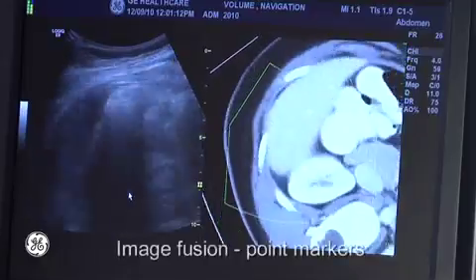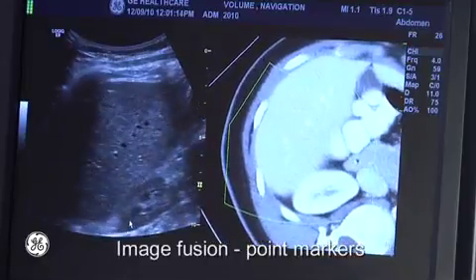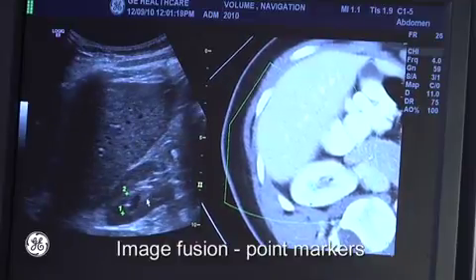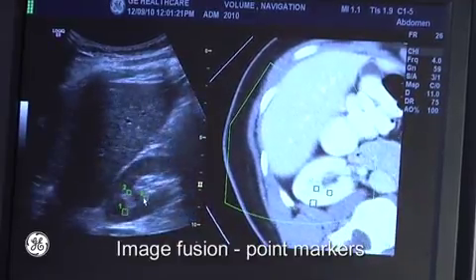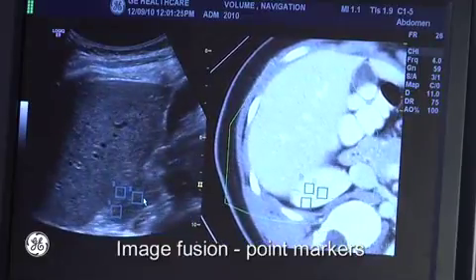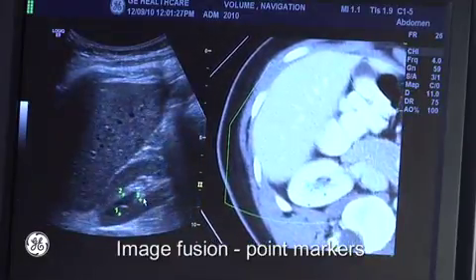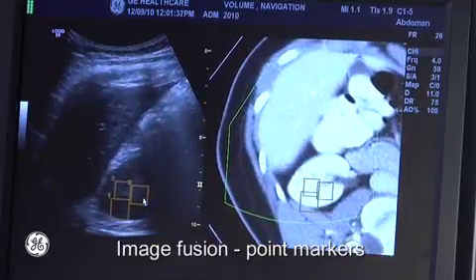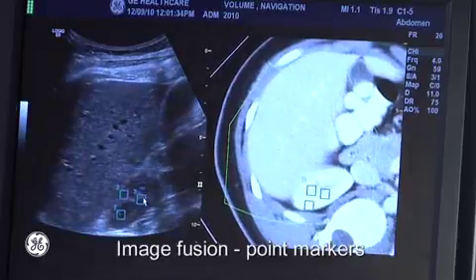And now when I scan, I'm going to drop one right here. And I'll put one over here and one over here. And you see the numbered 1 through 3 as an example. As I scan away, the boxes get large. As I scan closer to them again, they become crosshairs. And as I scan the other way, the boxes change color and become large again. This way I can keep track of each of my GPS markers.